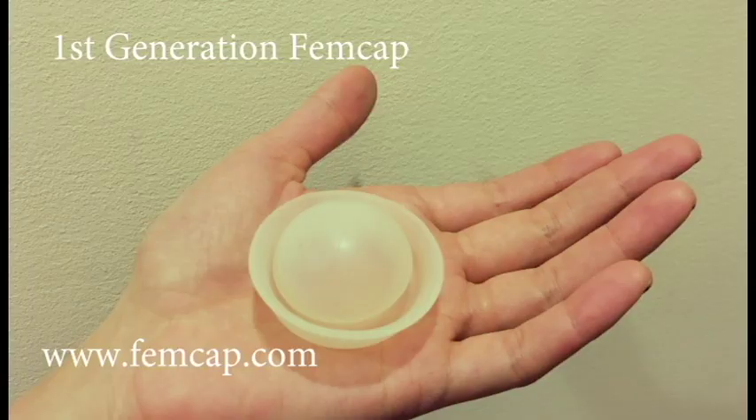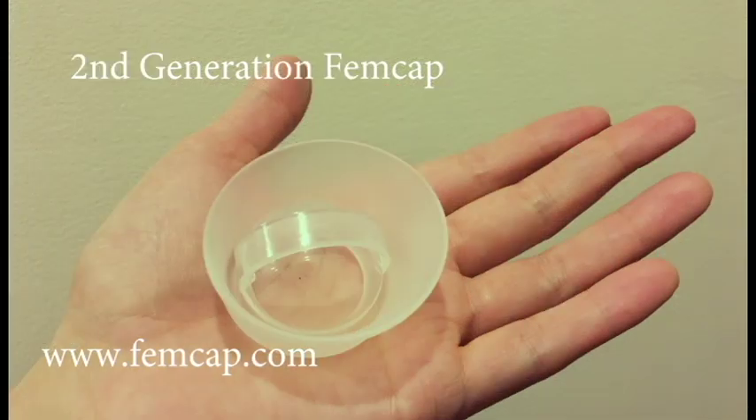Hi! In this video I'm going to explain the difference between the first generation femcap and the newer improved second generation femcap. There are very few differences between the first generation and the second generation femcap, but they're very important.